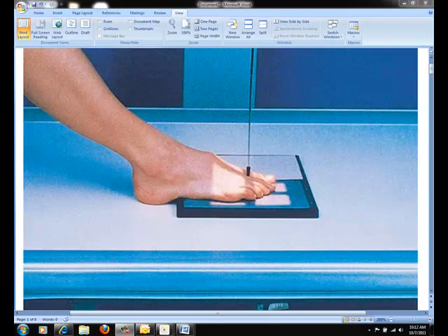Then touch the knees together to improve immobilization of the patient. Center the toes directly over the IR. Direct the central ray perpendicular through the third metatarsal phalangeal joint.